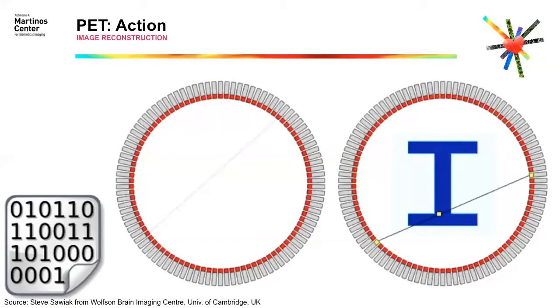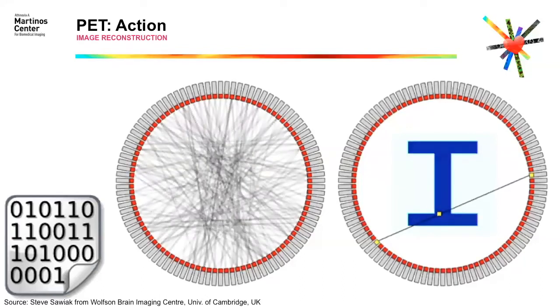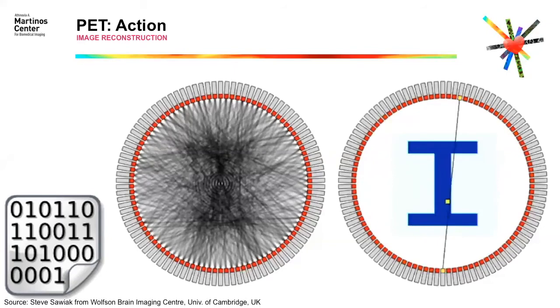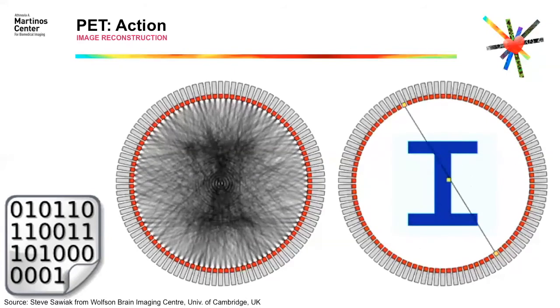So how am I going to reconstruct it? Well, basically, I'm just going to use those lines, color those lines, and I will show you in a second how. But I can basically by now just color those lines, joining those two PET detectors that were hit, and I start accumulating millions of that, like this. So millions of these positrons are annihilating with electrons within that letter I, the patient in this case, it could be the brain.